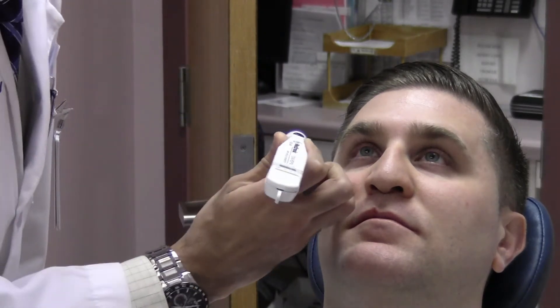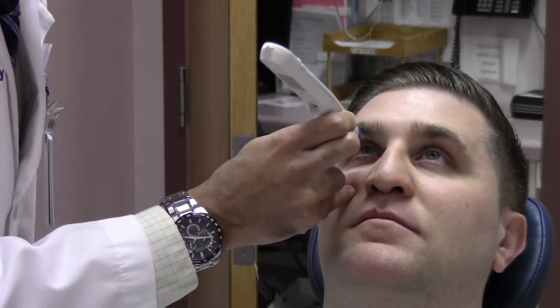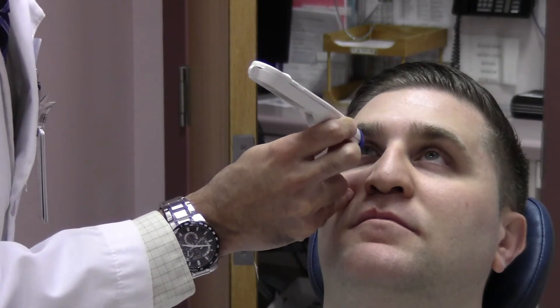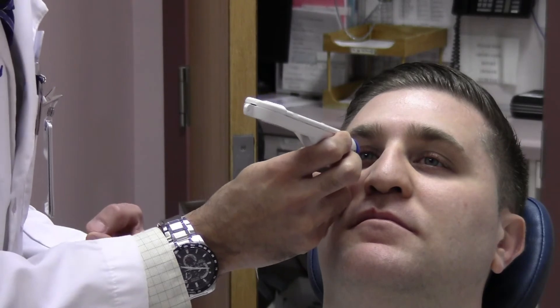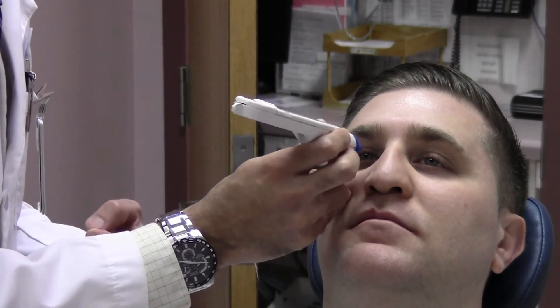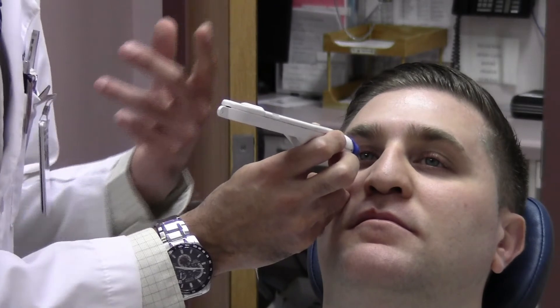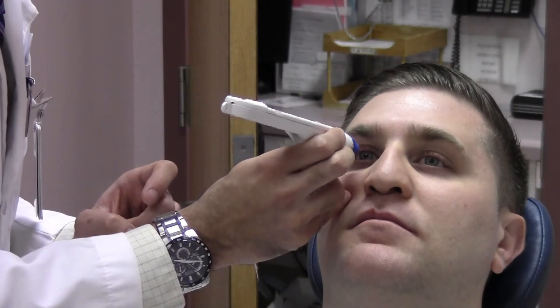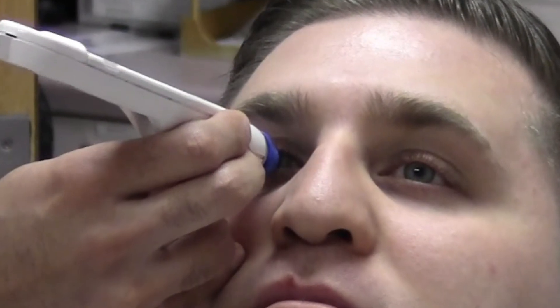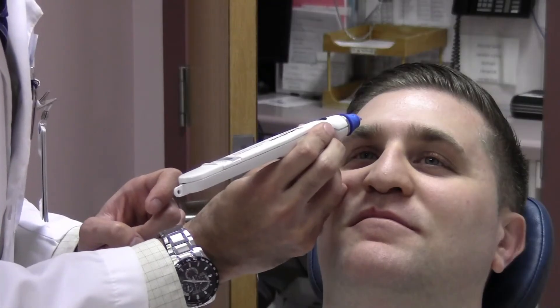Now to check the pressure, take the tonopen and rest one of your fingers on the patient's cheek. Move the tonopen into a perpendicular position and have the patient look straight ahead. The motion is a quick tap on the cornea just like this until the tonopen beeps and the pressure is read. And the pressure is a normal 21.